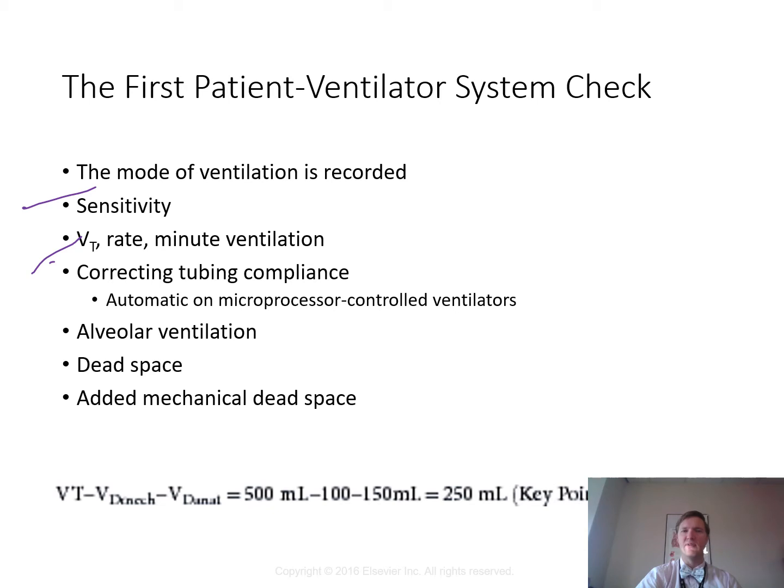But if we don't, you can still measure tidal volume on a respirometer, like a Wright's respirometer, if they're doing minute ventilation. And then you're watching a clock with a sweeping hand and looking at their minute ventilation, dividing by the rate, and that gives you their average tidal volume. That was traditionally done with older ventilators, like when we set up the IPPV as a ventilator. But it can also be used to verify digital readouts. So if you think that the machine is inappropriate or not calibrated appropriately, the patient's still safe, in theory, you could use this to confirm what the ventilator is saying the patient's doing.